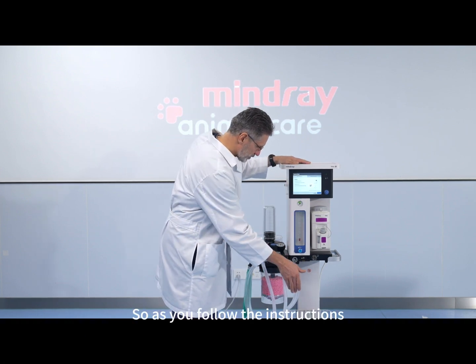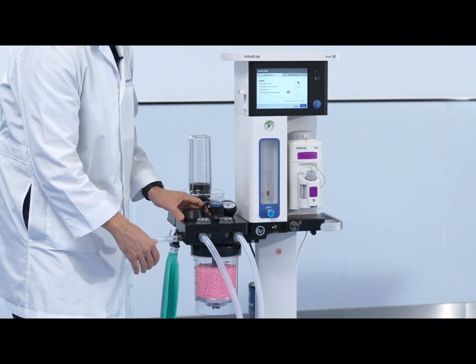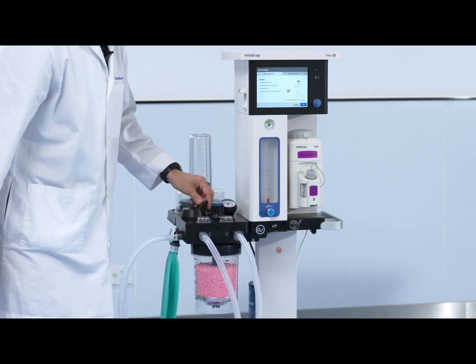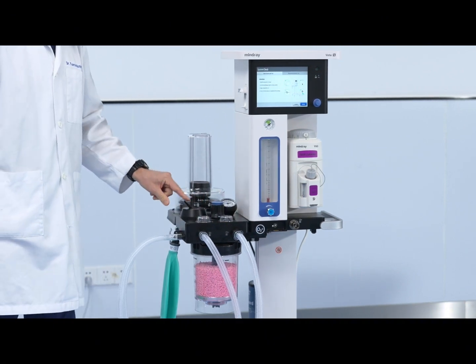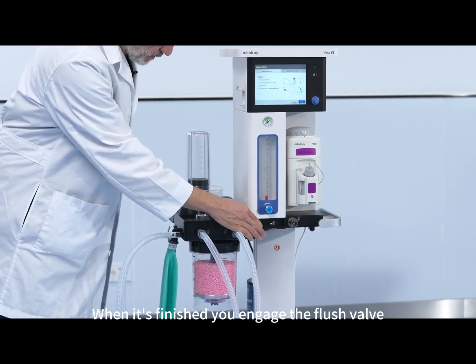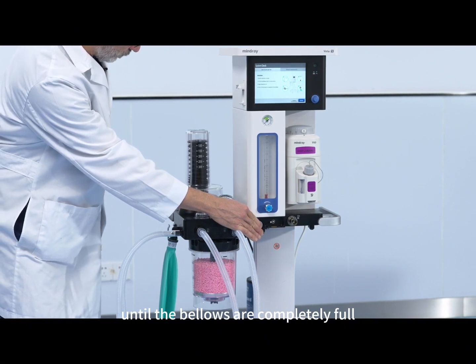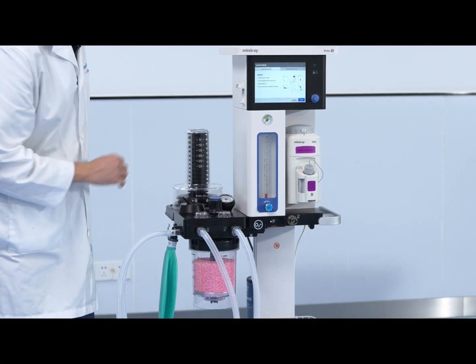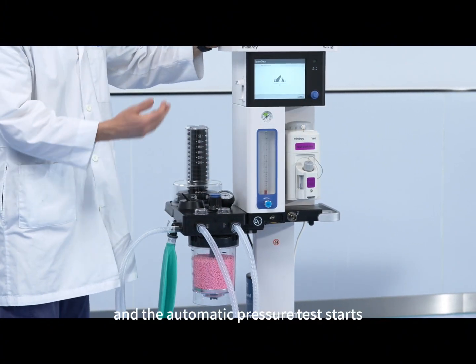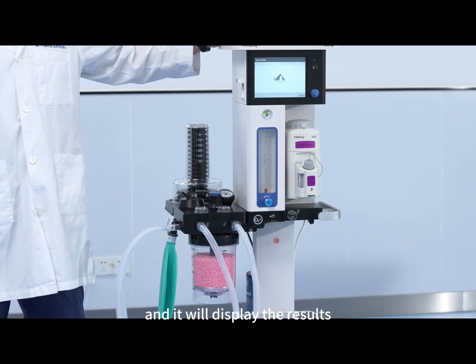Following the instructions, you put the Y-piece into this pipe, close the fresh gas flow, and switch into automatic mode. When it's finished, engage the flush valve until the bellows are completely full. When they are full, press the continue button and the automatic pressure test starts. You only have to wait until it's finished and it will display the results.